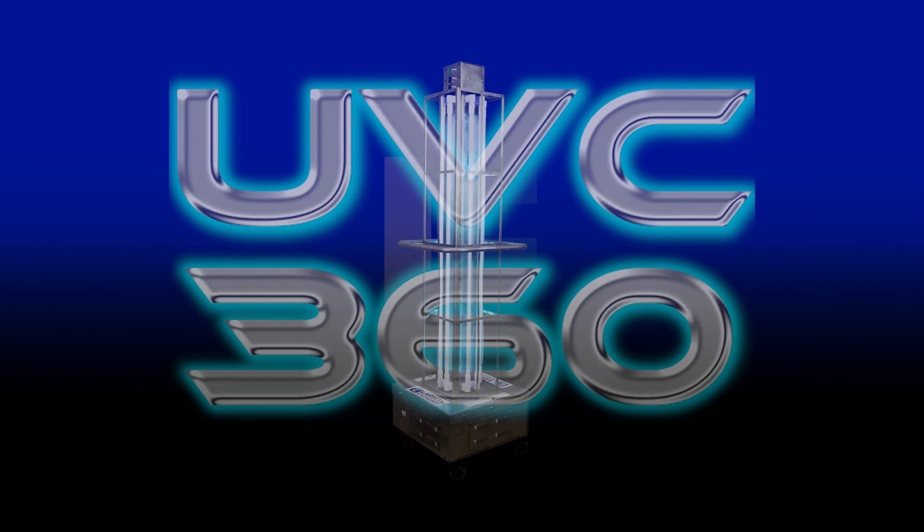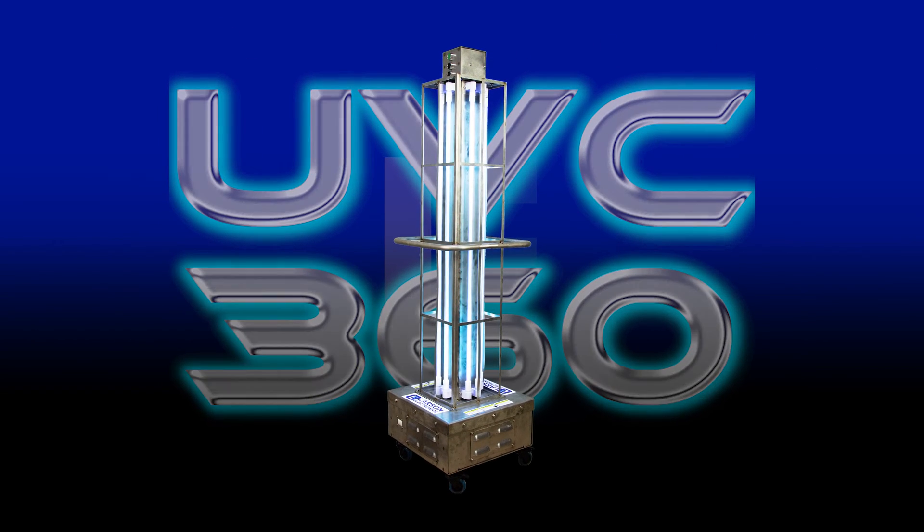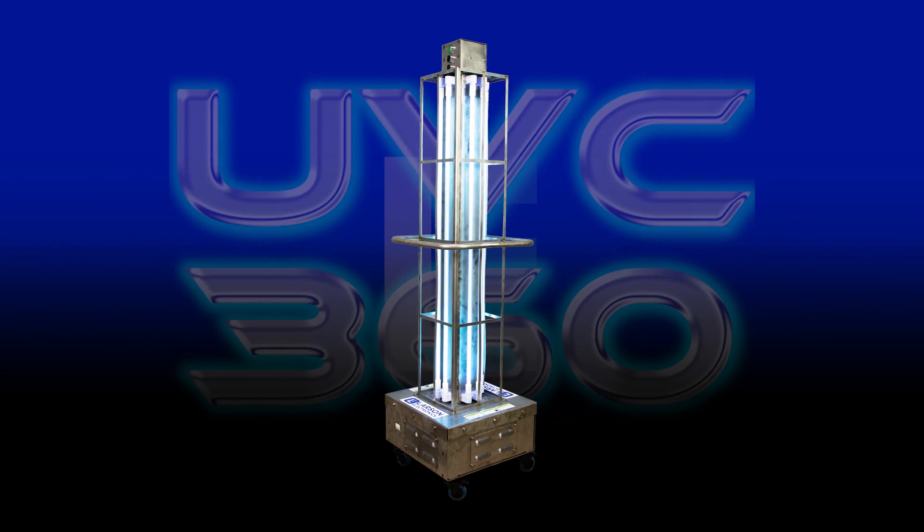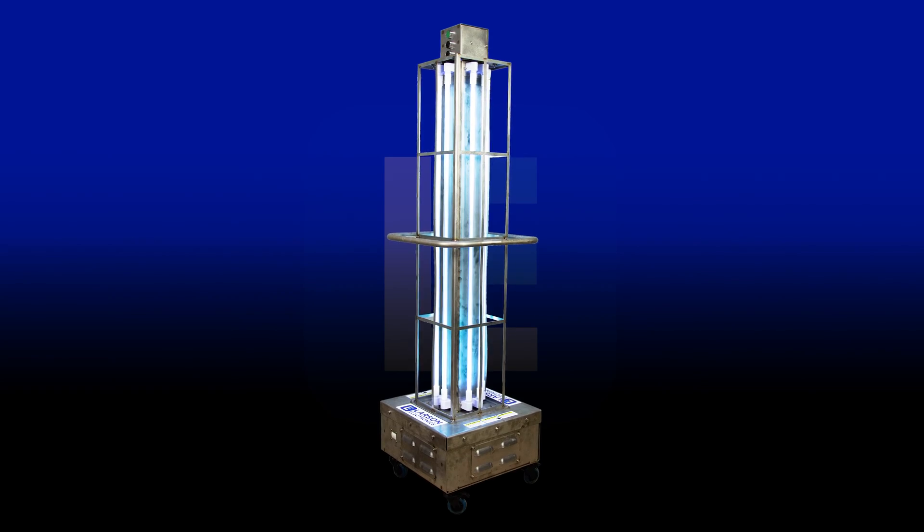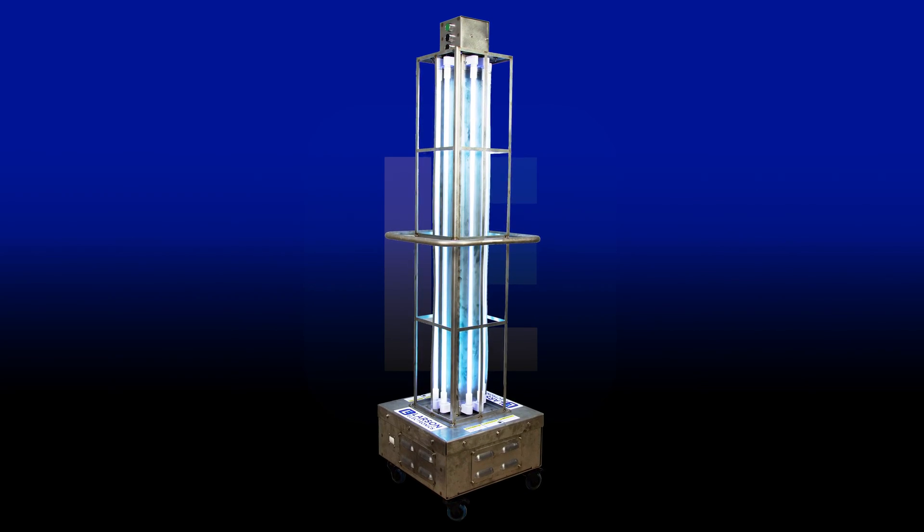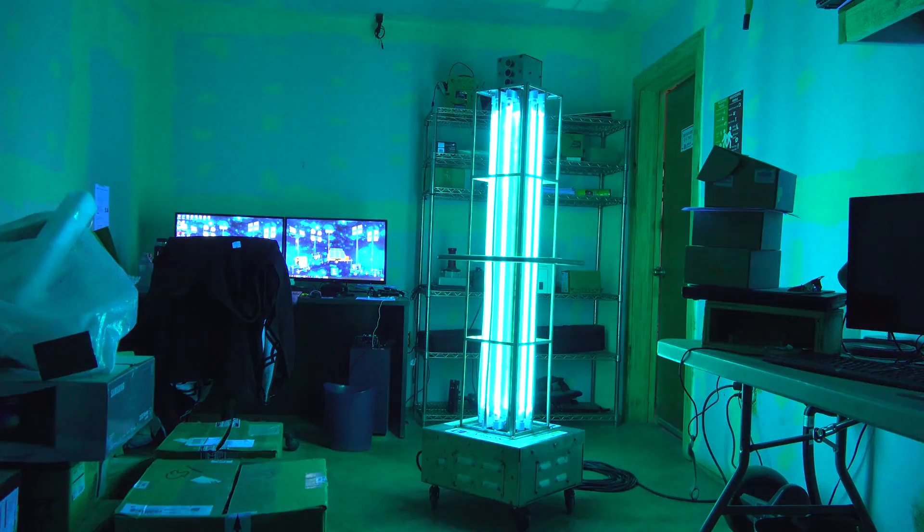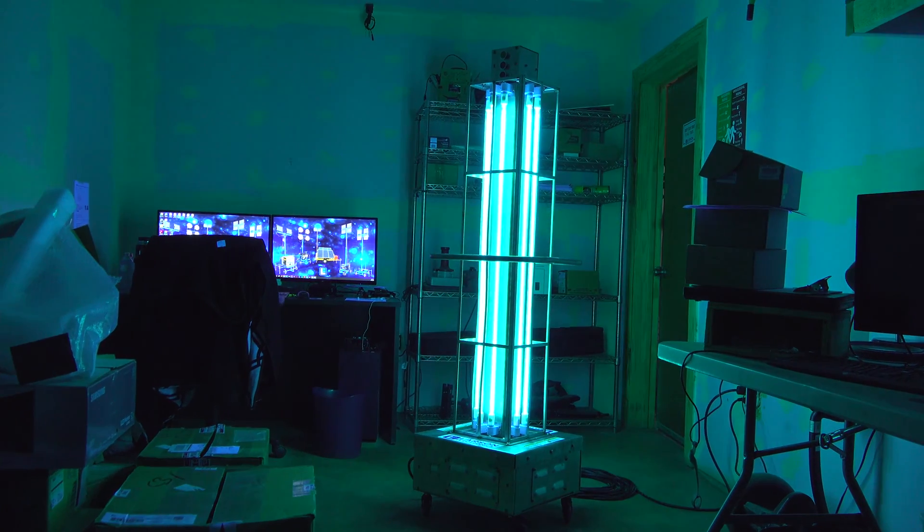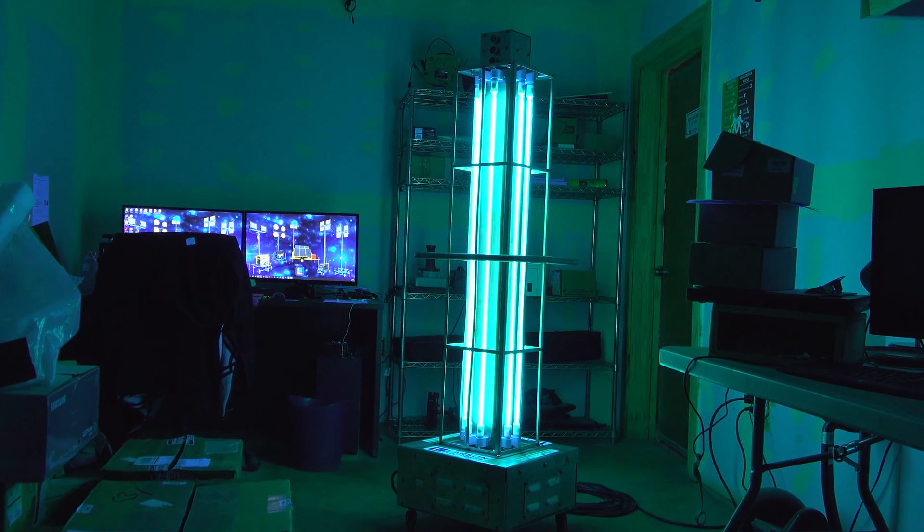UV Sanitation Carts are an optimal way to disinfect large industrial and commercial areas such as warehouses, manufacturing facilities, schools, office buildings, and medical facilities.